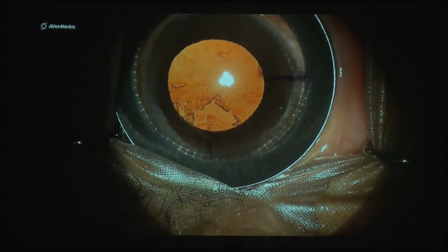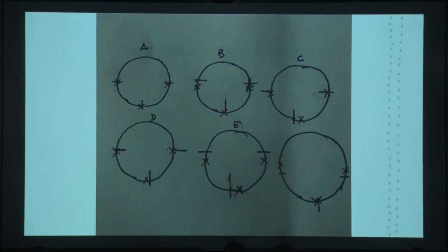So I came up with some algorithms here. These algorithms may be useful for those who are using the manual marking system. See, if all 3 points are right, this is right. If the patient tries to close the eye and your 90 degree mark gets shifted upward, that will be the same parallel distance from the actual marking, and if you set the manual marking system, you get this one.